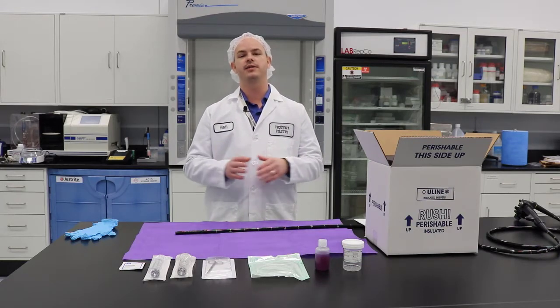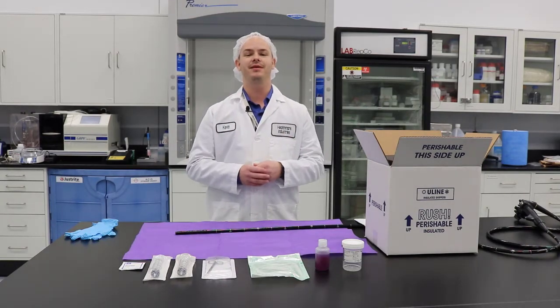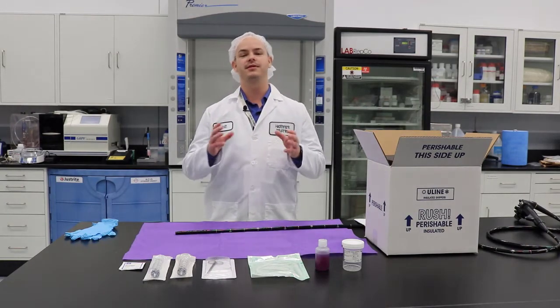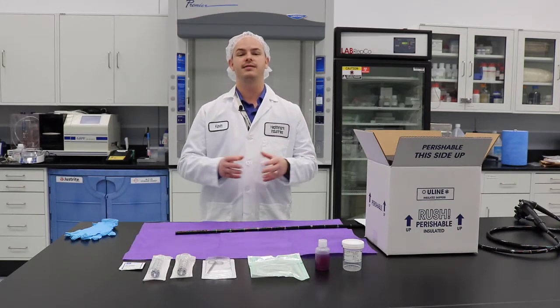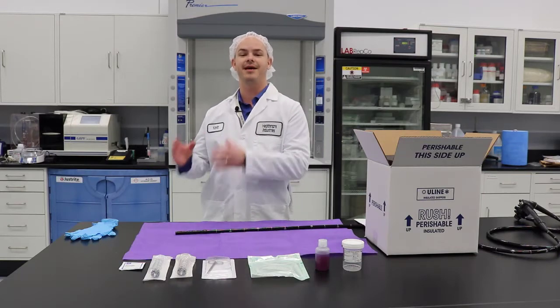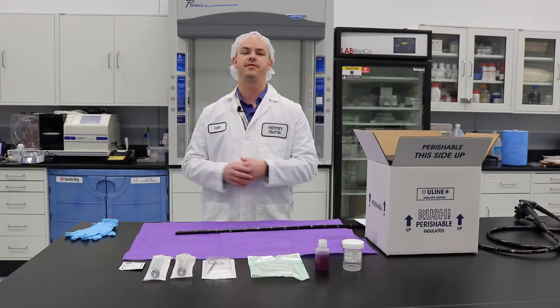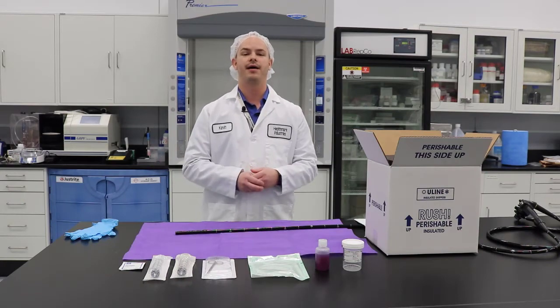Before we get started, we want to make sure to mention that you will need the appropriate PPE for this. It's going to be a two-person procedure to perform this sampling. And lastly, at the end, you're going to get your specimens ready to send to Nelson Labs. That's going to be very important — how you do that and that you're working with them on this procedure.